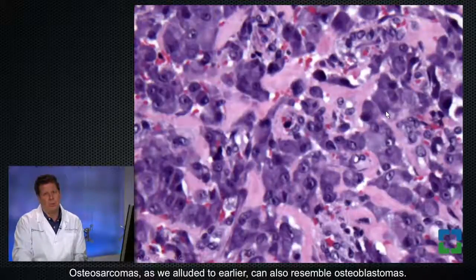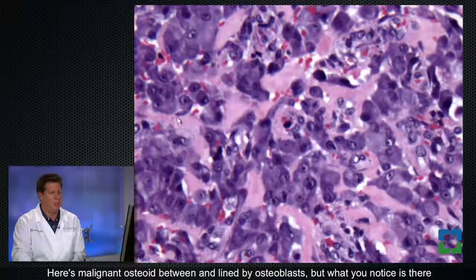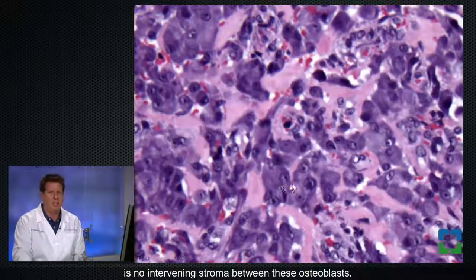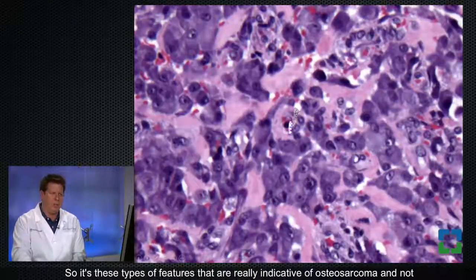Osteosarcomas, as we alluded to earlier, can also resemble osteoblastomas. You see this process here. Here's malignant osteoid between and lined by osteoblasts, but what you notice is that there is no intervening stroma between these osteoblasts. It's gone. So these types of features are really indicative of an osteosarcoma and not osteoblastoma.